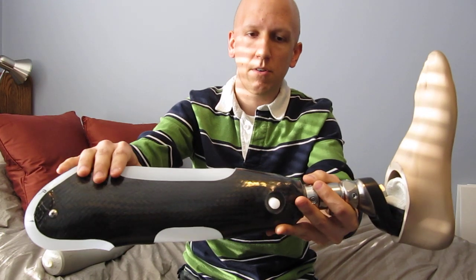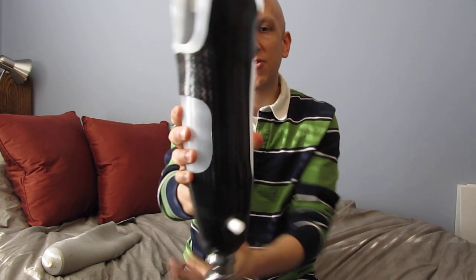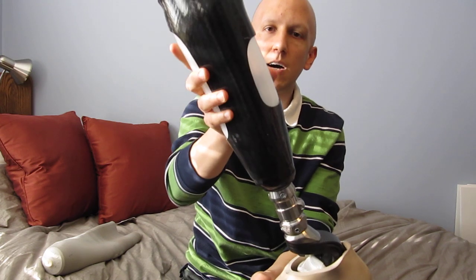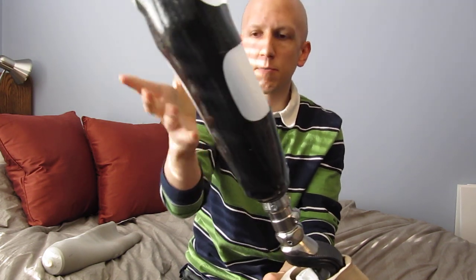It has a carbon fiber outer shell and that covers a plastic inner shell. The plastic is molded to my leg and it's flexible, which allows it to move with me as I walk. It's pretty comfortable.